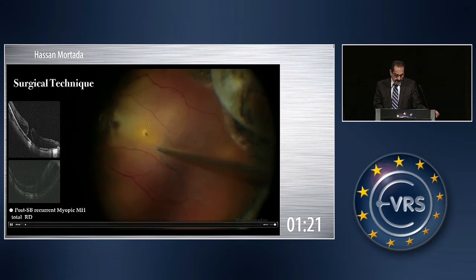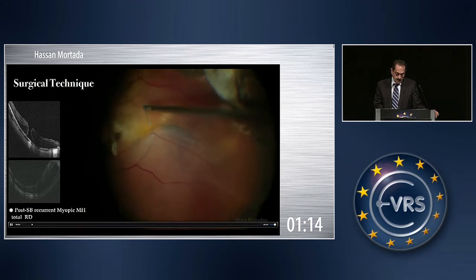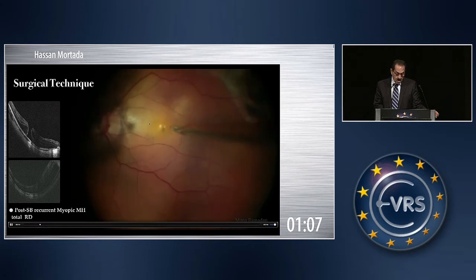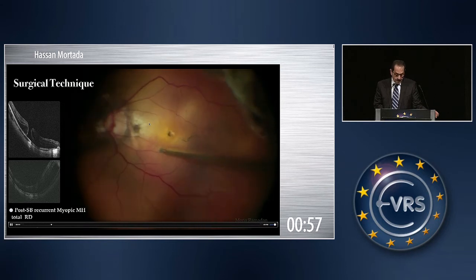Another case of recurrent retinal detachment — please notice that this is not the ILM. It is a part of the posterior hyaloid or an epiretinal membrane. This is not the ILM proper, and this is known from the texture and the friability of the tissue. So you have to look for the ILM.